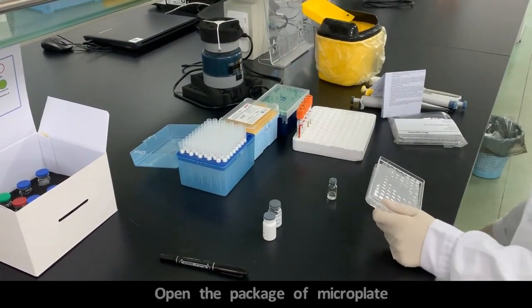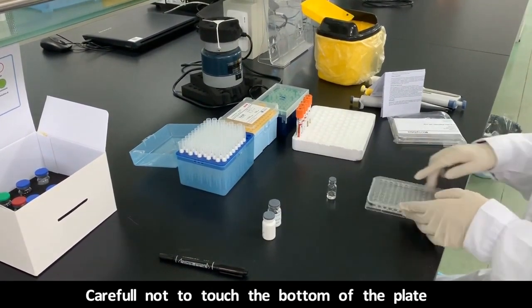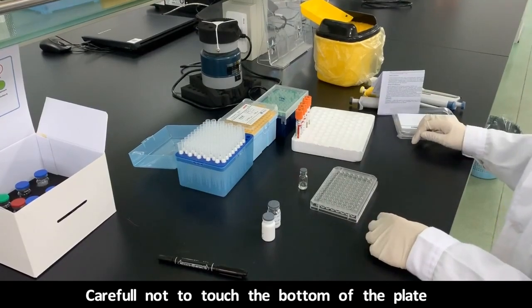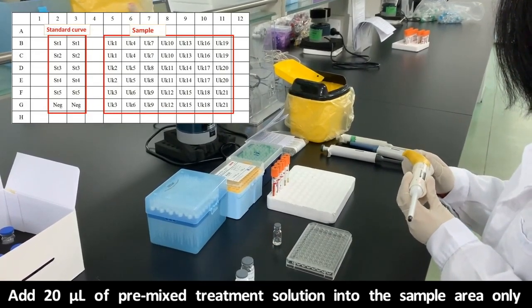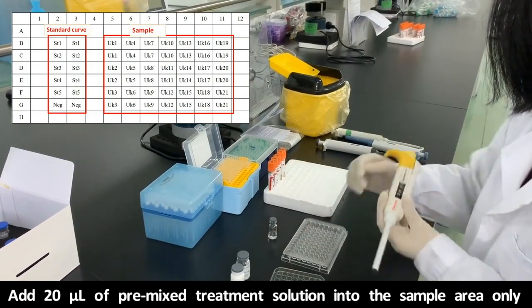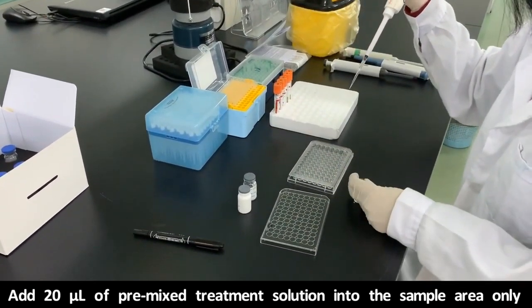Do not touch the bottom of the plate, and orientate the plate so that you can then set up these samples and standards as shown in this grid. The first set to be set up are the samples, and first you use 20 microliters of this premixed solution into the sample area only.